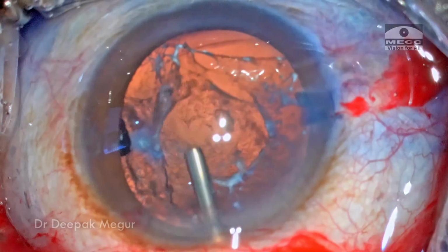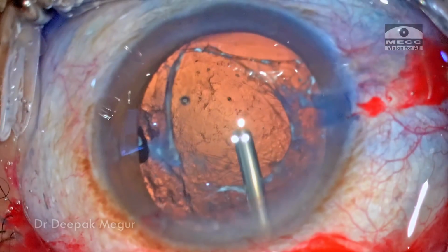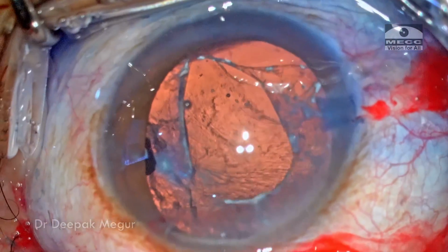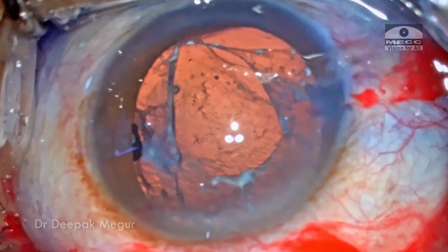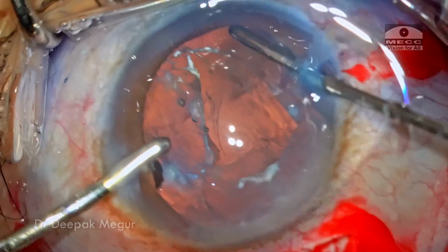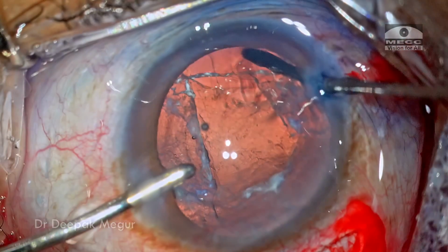Now before irrigating out all this muck which is inside, I thought I will go ahead and do a vitrectomy first, because when we introduce irrigation anyway the vitreous might prolapse and may displace the bag a little bit more. With that idea in mind, I'm going to do a vitrectomy first.